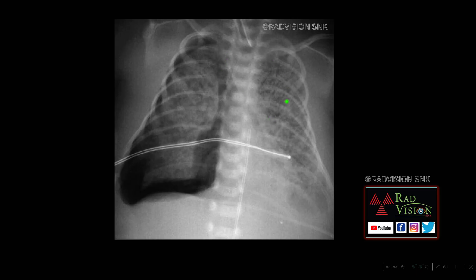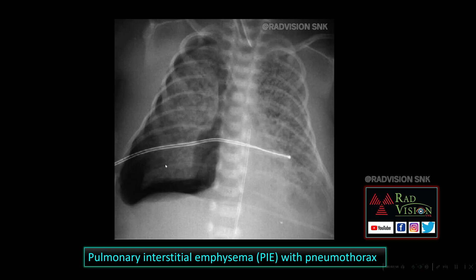Next, this is a respiratory distress case where a child presented with breathlessness. Here you can see there are multiple streaky lucencies noted in the lung parenchyma along the bronchovascular markings and also in the interstitium. There is free air in the right hemithorax. This is a classical case of pulmonary interstitial emphysema. Whenever you see multiple lucencies scattered in the lung parenchyma and along the interstitium and bronchovascular markings, along with pneumothorax in a child with respiratory distress, definitely suspect pulmonary interstitial emphysema.